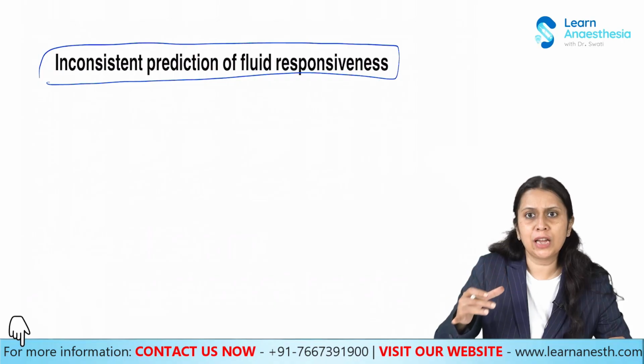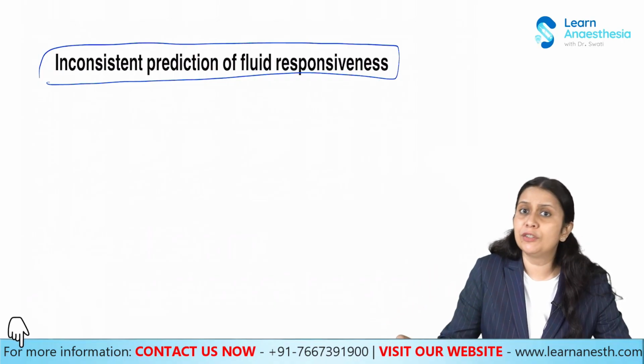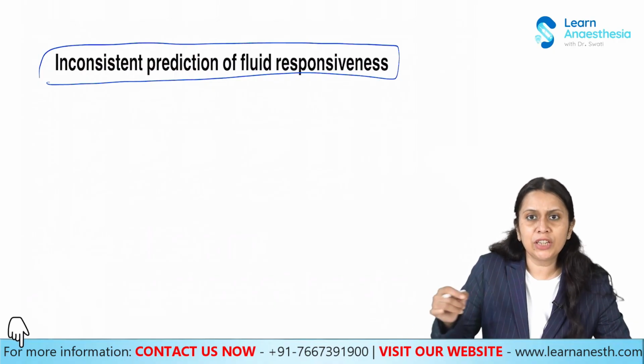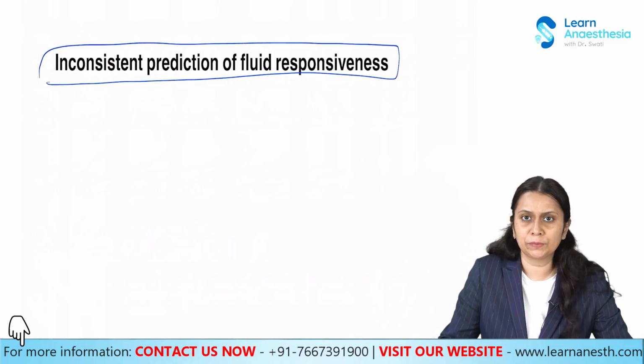Now, if the patient has any regurgitation or any right ventricular dysfunction, then CVP would not measure the right atrial pressures accurately, and it would not be very helpful in guiding our fluid therapy to the patient. And apart from this, change in the intrathoracic pressure along with mechanical ventilation was also affecting the reading of the central venous pressure, right?